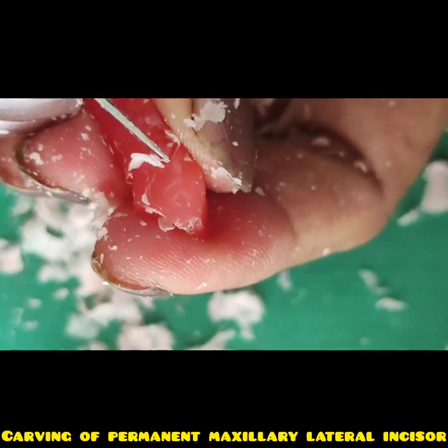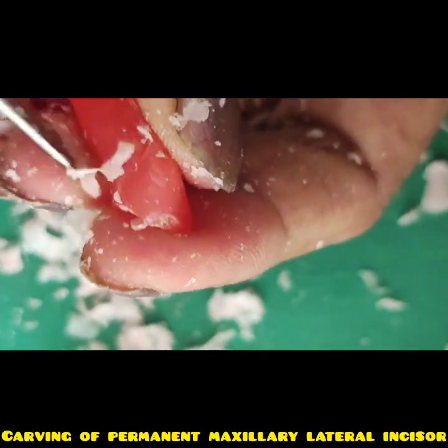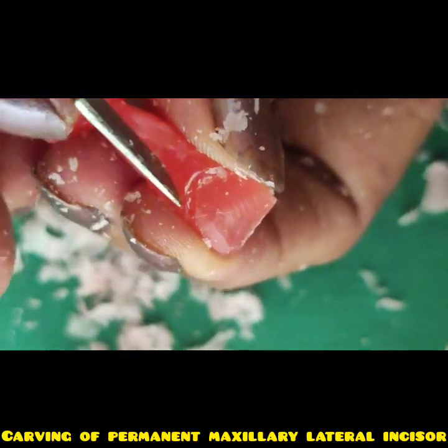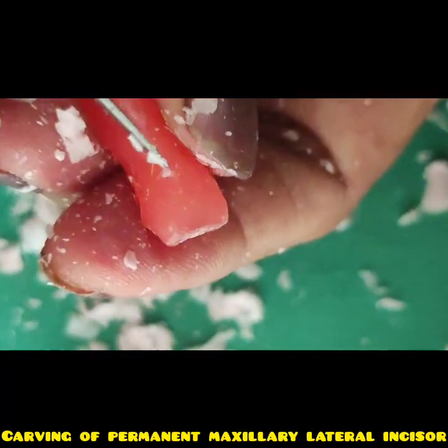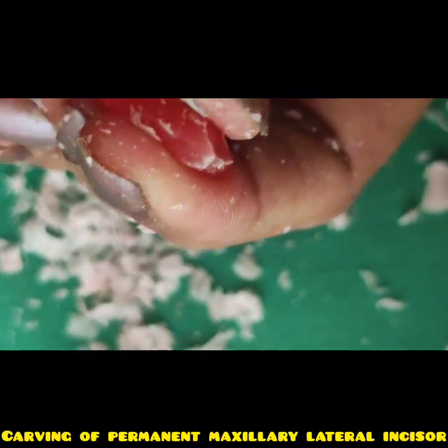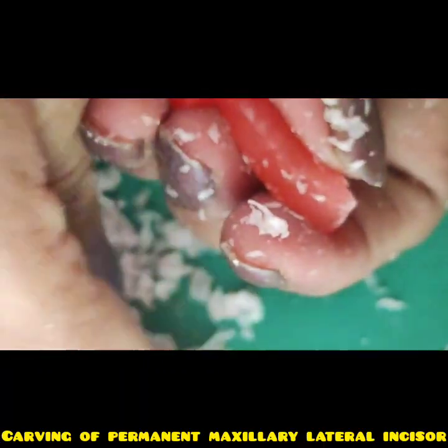Here also it should be convex towards the crown. Reduce this extra wax and merge it with the root surface and crown surface.